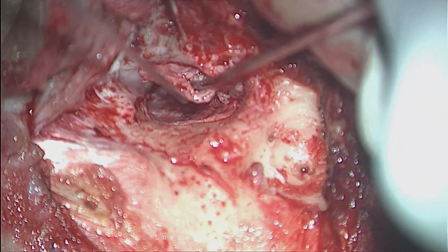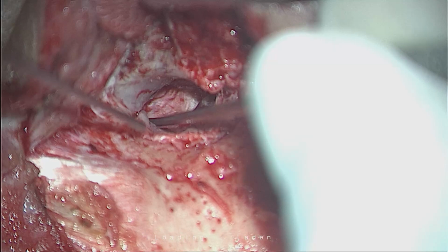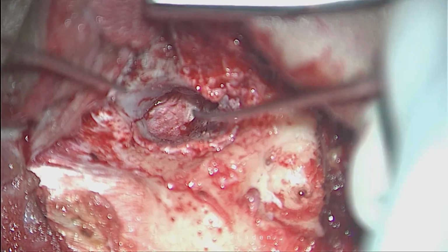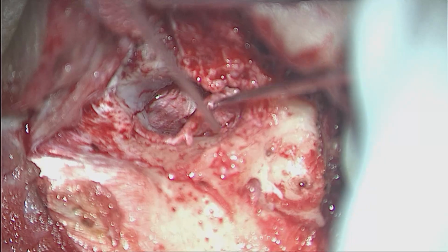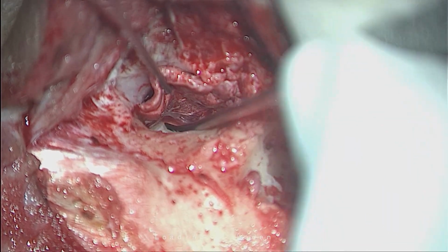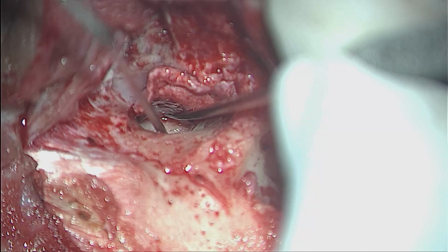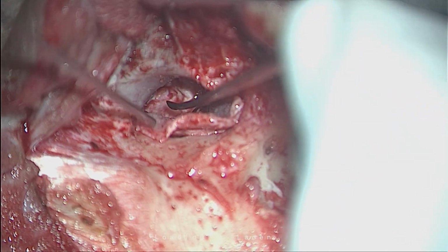My second part of the grafting is to replace the tympanomeatal flap posteriorly and inferiorly. See this? Yes. This flap is going to come above and the mucosal layer is below, as we have seen. So this graft is literally sandwiched between these 2 layers, and I will make it one surface. See, by surface tension, these surfaces come to each other. See this? The graft and the flap. Yep. They take on each other.